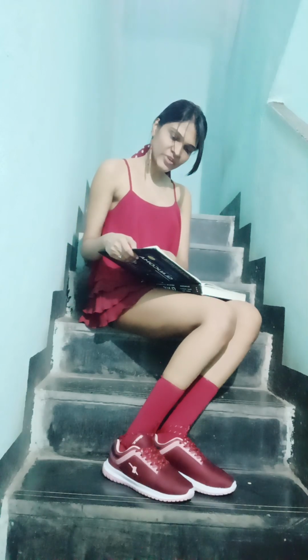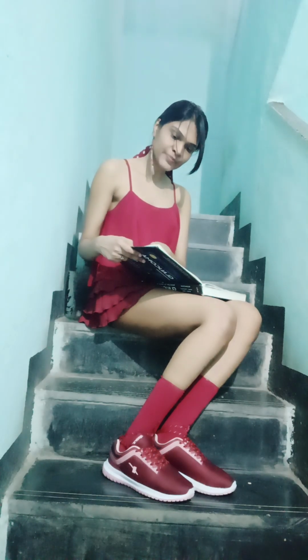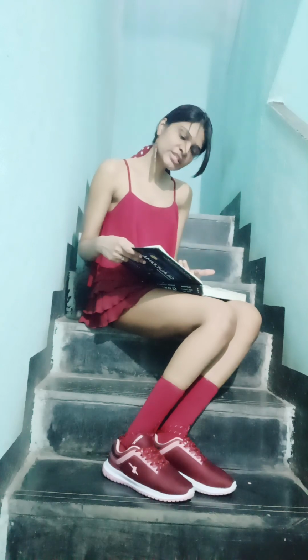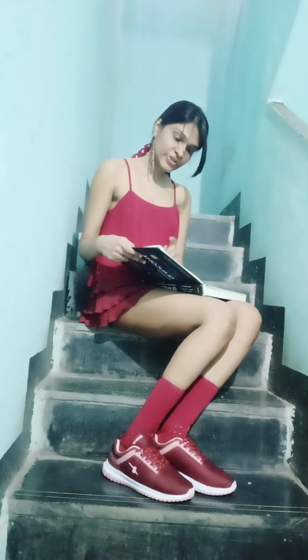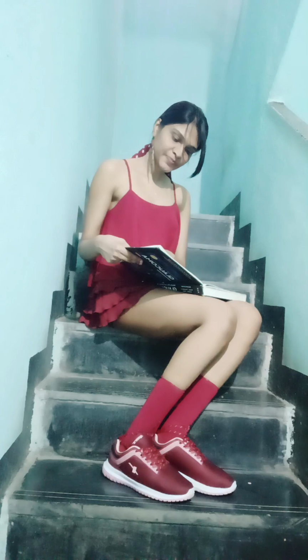Recording gonioscopic findings: various classification systems have been suggested for describing the width and appearance of the anterior chamber angle. However, descriptive words and drawings are probably the most useful technique for recording gonioscopic findings. The recorded data should include a configuration of the angle, depth of the angle on the basis of the most posterior structure that can be seen, degree of pigmentation, and presence of abnormal structures.